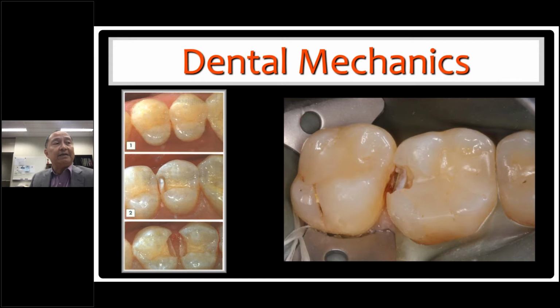He went on and prepared a cavity. He then stopped, actually, on slide number 2, at this point in order to show us the justification for cutting in, which is this demineralized area in the enamel. Then he went on and cut 2 symmetrical boxes, which were designed mainly for amalgam. However, in this case, he's going to use glass ionomer cement.